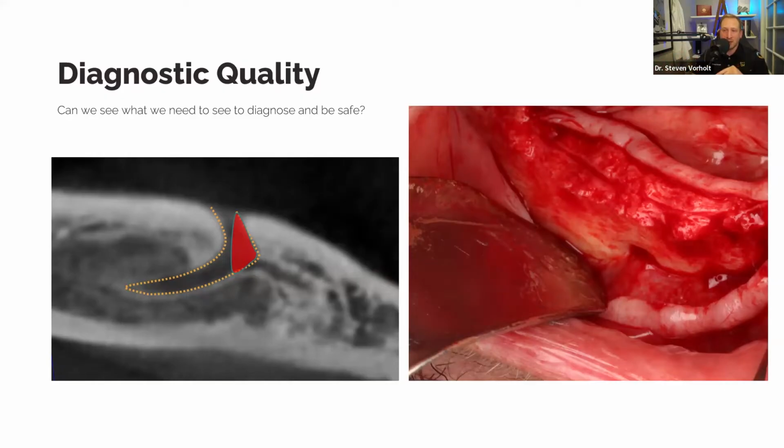And here you can see outlined in the dotted orange, that is the mental nerve, or the IA, as you call it, coming out of the mental foramen. And where you see it change, just mesial or anterior to that kind of bulge, that is the incisive branch of the nerve. You can see the lumen changes quite drastically into a smaller vessel, and that's where all the innervation for the lip is gone by that point. That's all exited the mandible.